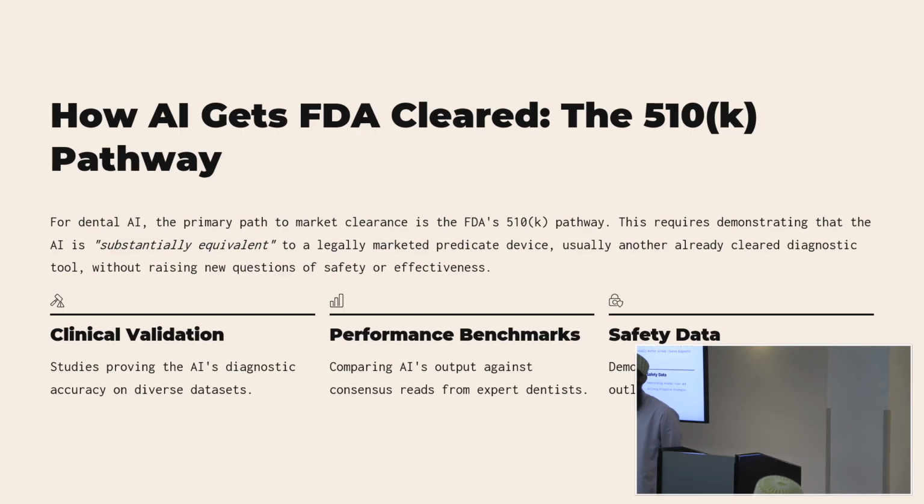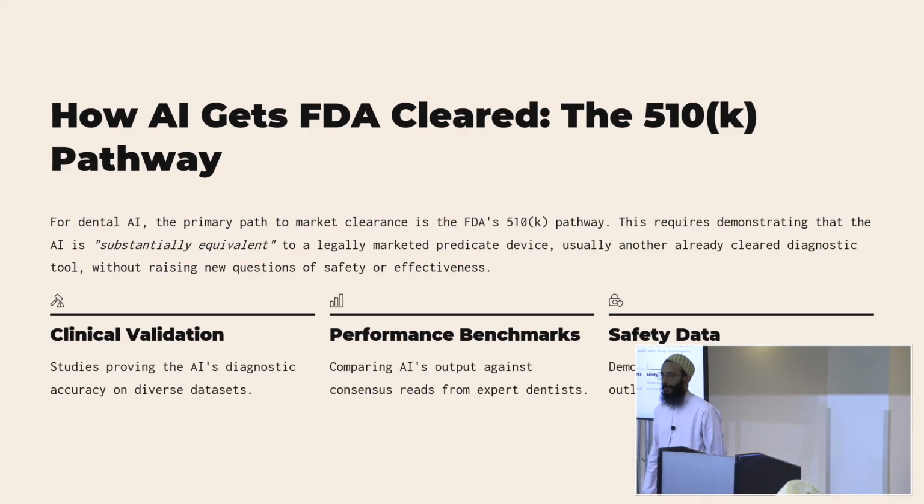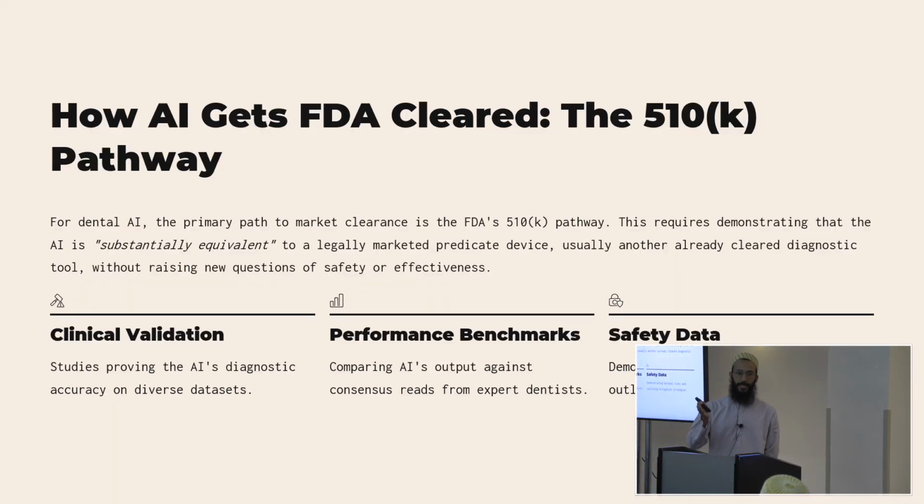We did have scanned radiographs. It did work on scanned radiographs, but it's just not going to be as accurate. Part of my job, in the very early days, was to go in and help people set things up. Now it's been streamlined and it's really easy to get set up. But in the early days, I would remote onto their computers, help extract the radiographs and do all that stuff. And some people just had scans.